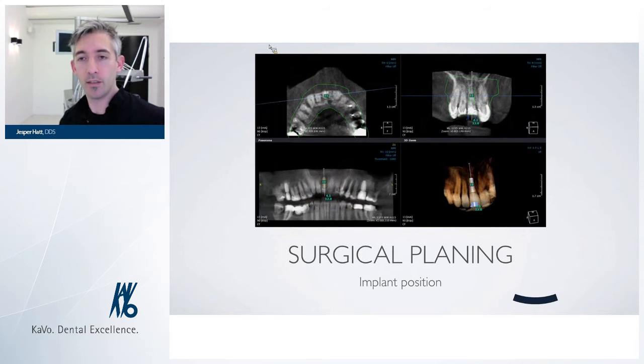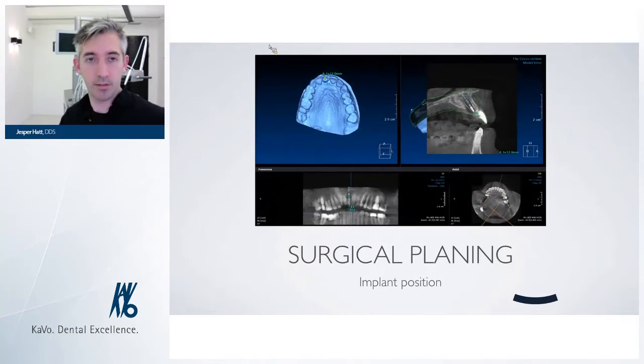The IntoGuide software is just a plugin to a viewer by the company that makes this. What's it called? On-demand 3D, the On-demand 3D viewer.